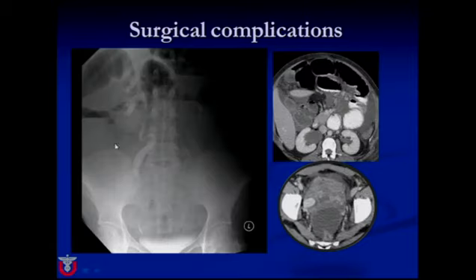Other surgical complications to think about. This lady had a horrible experience with her delivery. She required a crash C-section. She was desperately ill.